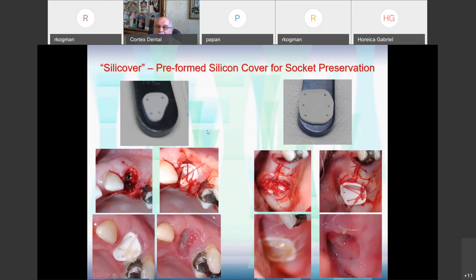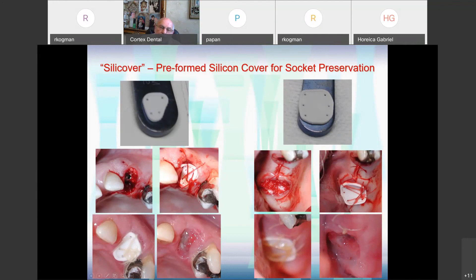Now another idea I had: a silicone socket cover — a preformed silicone cover for socket preservation. Instead of taking soft tissue from the palate, I made two shapes of medical silicone with holes — one for front teeth and one for back teeth. After filling the socket, I sutured the silicone in place. After two weeks I removed it, saving all the bone particles in place without losing any bone at all.